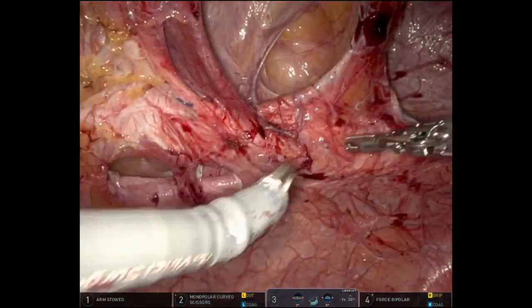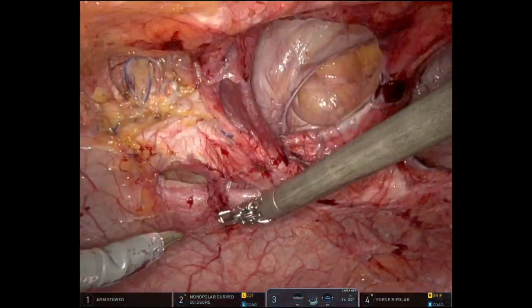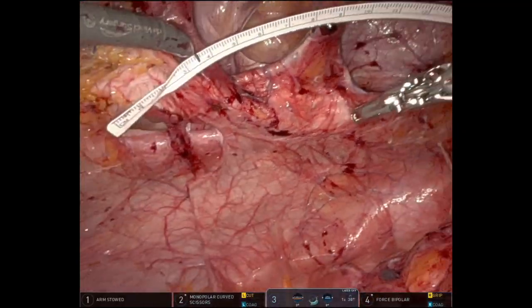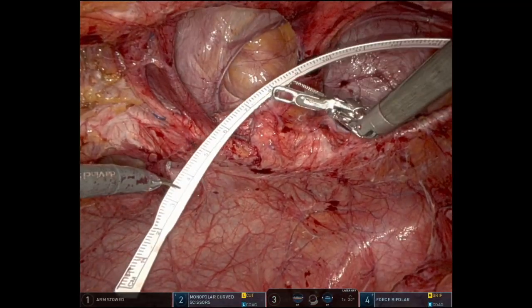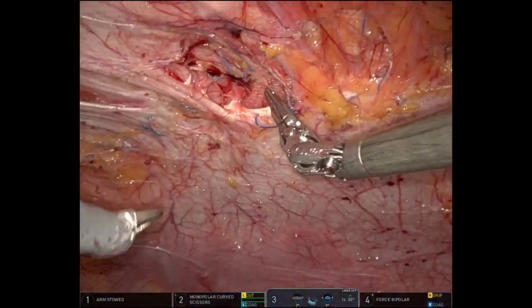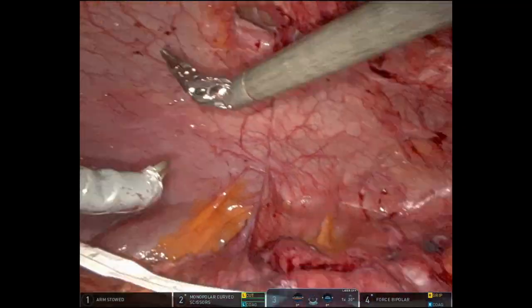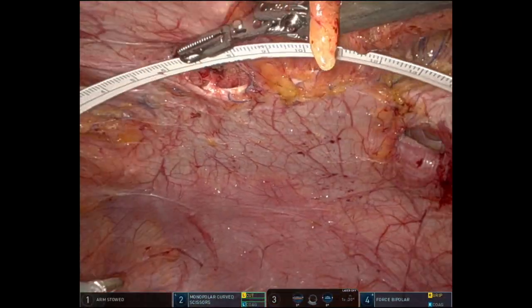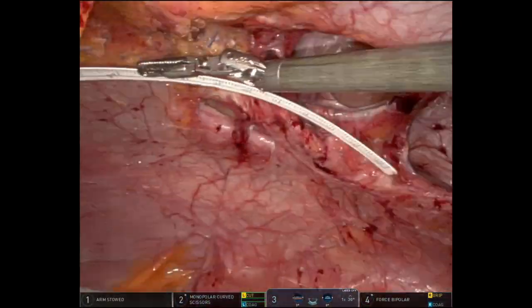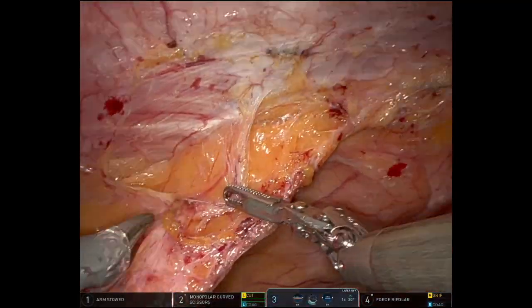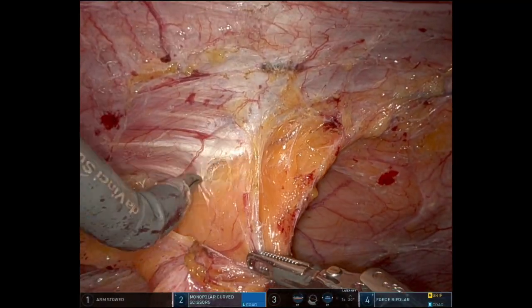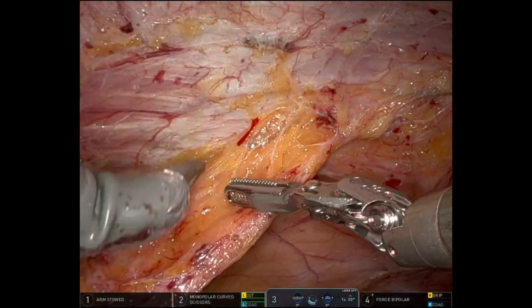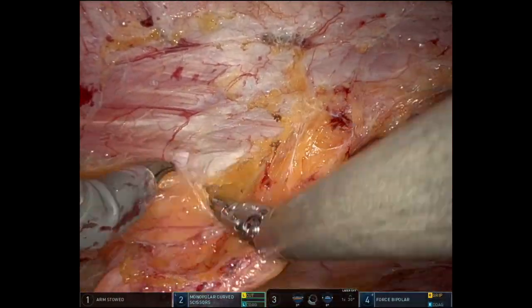Hello everyone. Here I'm performing a preperitoneal hernia repair on a patient with a large incisional hernia — a recurrent hernia, actually. The hernia defect measures about 20 by 8 centimeters in the region of M2, M3, and M4 by AHS classification.